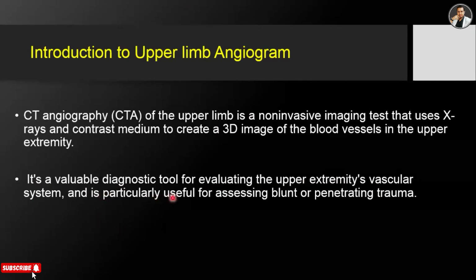It is particularly useful for assessing blunt or penetrating trauma. The vascular system of the upper extremities is very useful for observing the blood vessels. It is especially useful for observing veins that are deep.